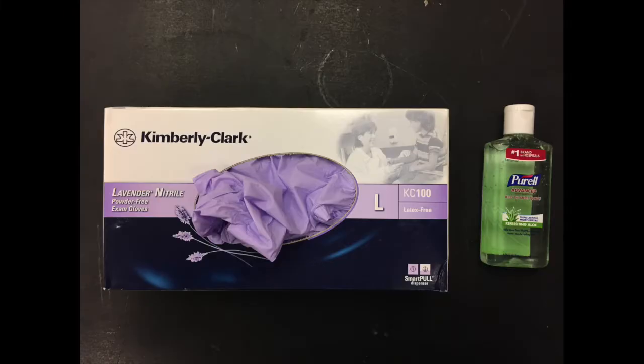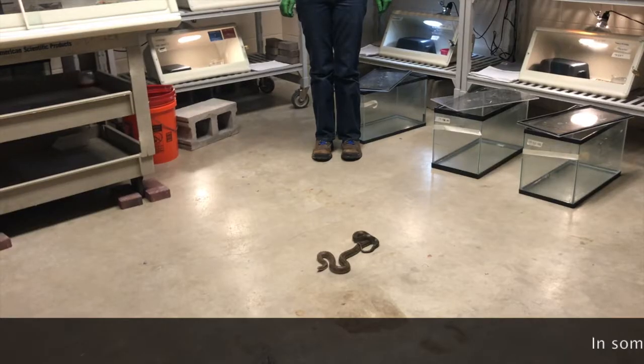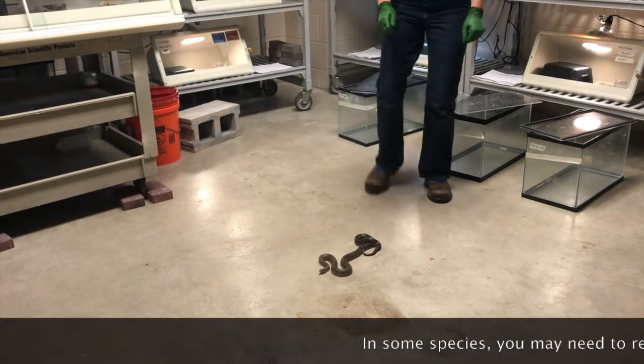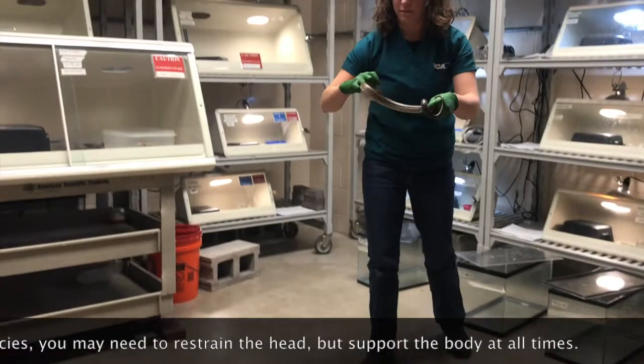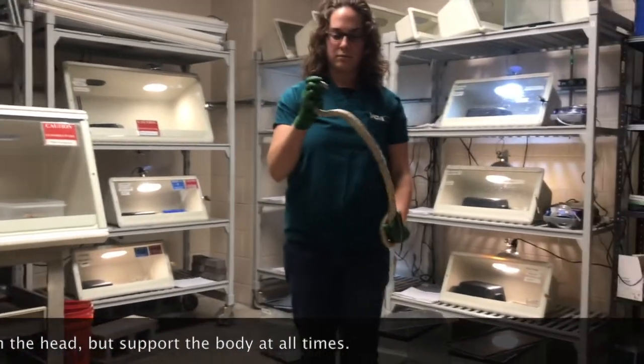Remember that biosecurity is of utmost importance to prevent transmission of snake fungal disease between snakes. Disposable nitrile gloves should be worn when handling any snake and should be changed between snakes. Snakes should be restrained firmly but gently, and the head should be controlled by holding at the base of the head to prevent bites. As much as possible, the snake's entire body should be supported.